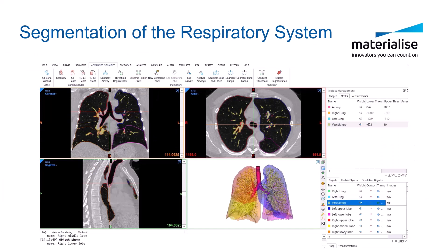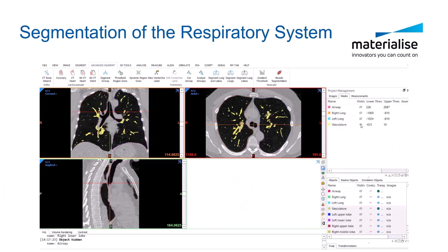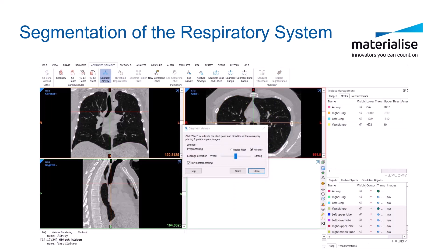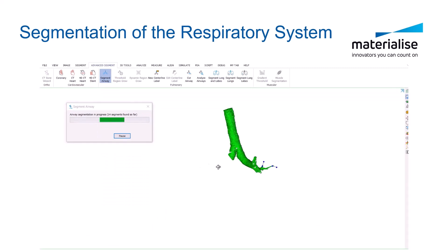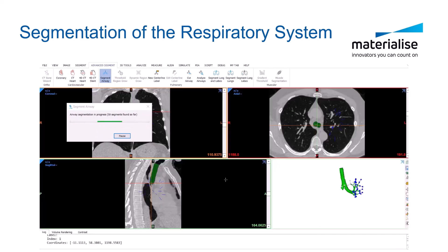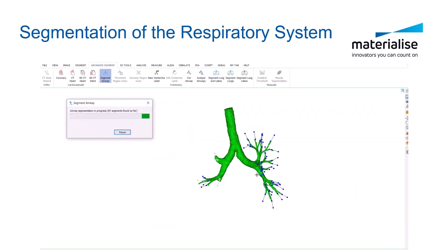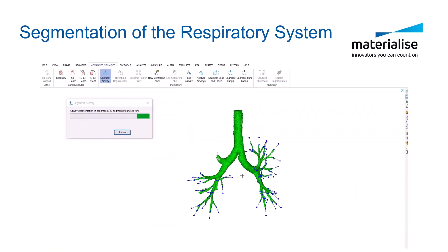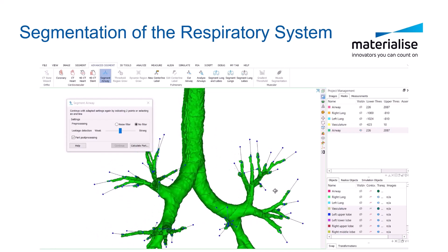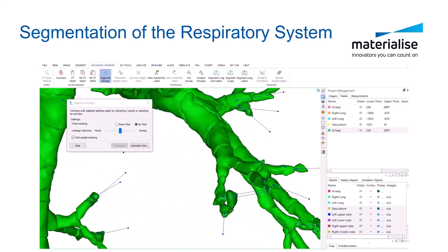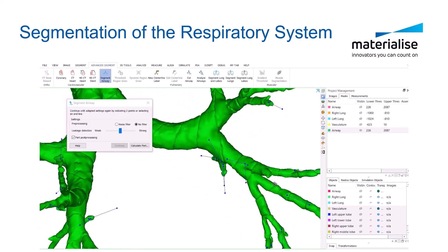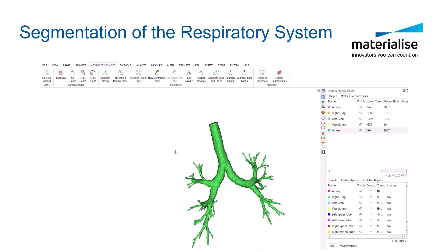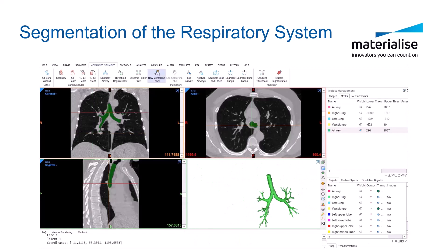Auto-segment airways in a fast, flexible, and effective way, and auto-segment the lungs and lobes with one click. Indicate the start of the trachea and let the tool run all by itself. Preview the 3D in real time and fine-tune any potential errors interactively. Create an airway centerline where all the branches are automatically labeled for you.